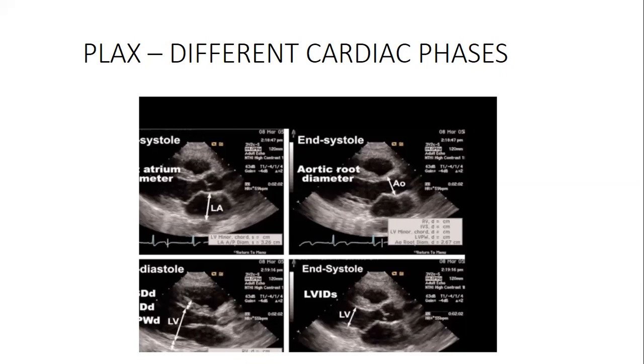We go to the Nyquist limit. The first question that I'm going to ask, not really a question, but what is a PRF? Because I want us to pick it from somewhere. What is PRF? Pulse repetition frequency. What is it? Anyone who went through it? I think people read it. And tell me the importance of PRF. You can go ahead, please.